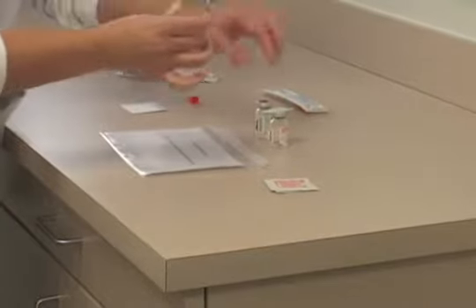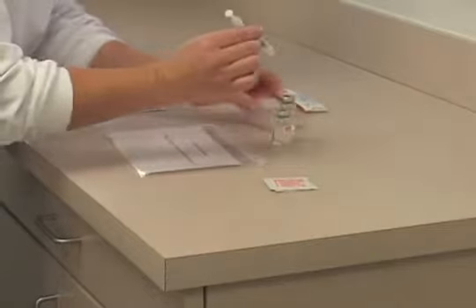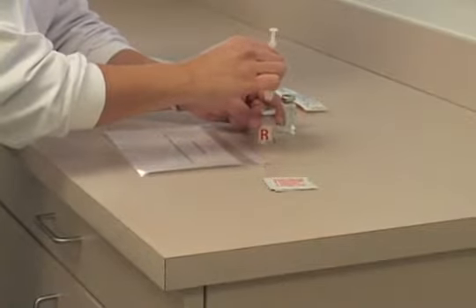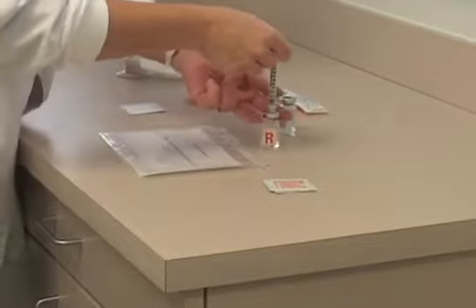Leaving the clear regular insulin vial sitting on a flat surface, inject remaining air into the airspace of the clear insulin vial. Leave the needle in the vial.